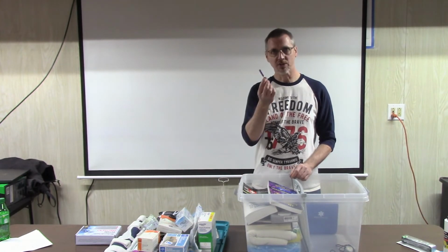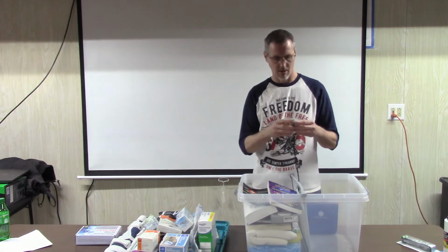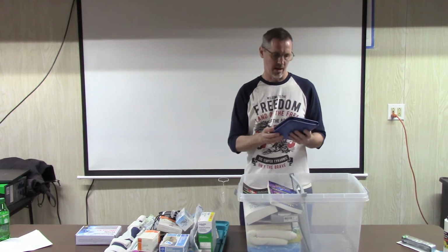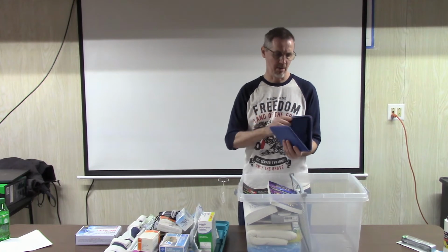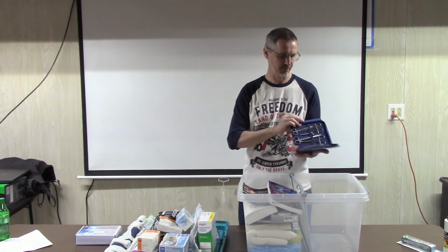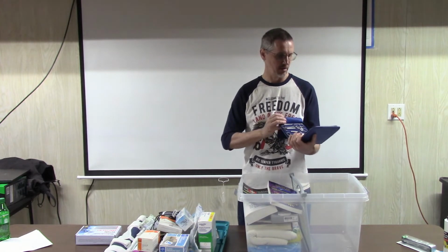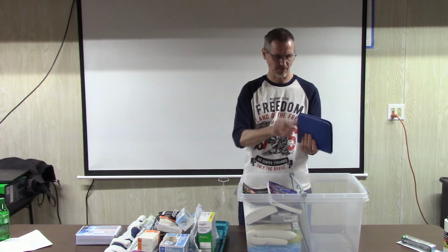This is the liquid skin bandage. We have a little pulse ox meter. Just stick it on your finger, it gives you your pulse and your oxygen concentration. And this is a polymedical surgery type kit. It's got the forceps and scalpel and so forth in it.